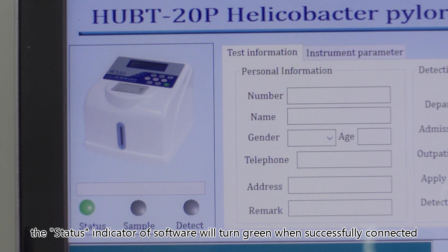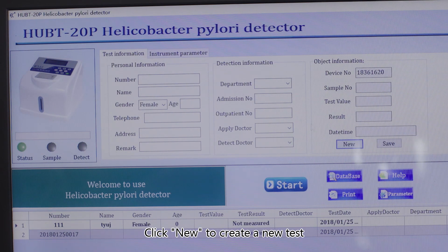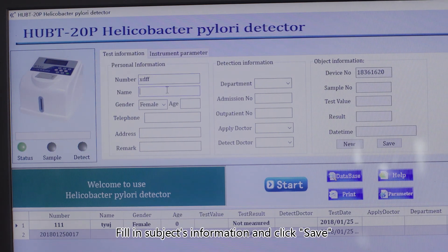Print the test reports with a computer connection. The status indicator of the software will turn green when successfully connected. Click 'New' to create a new test, fill in the subject's information, and click 'Save'.